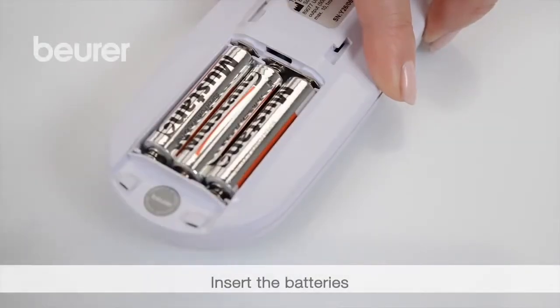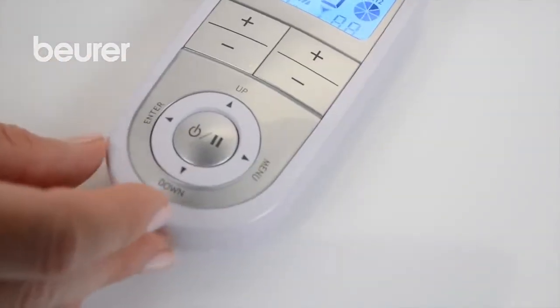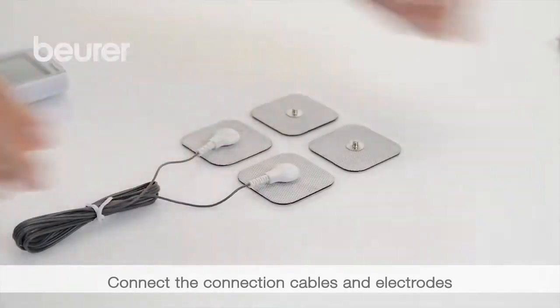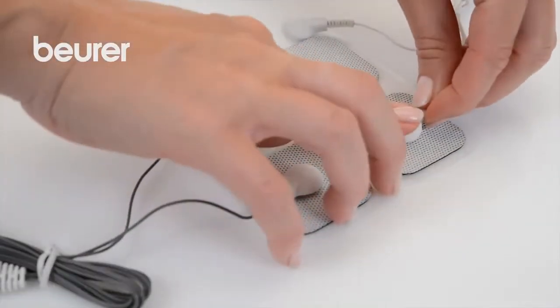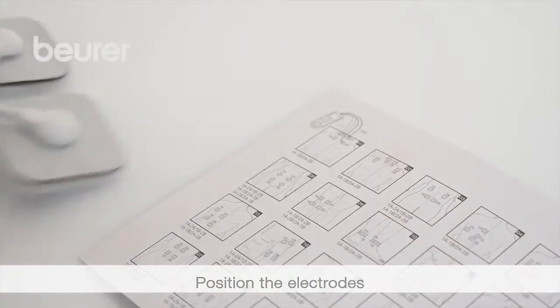Insert the batteries provided. Then connect the connection cables with the electrodes. Position the electrodes — the overview shows you how to do this.